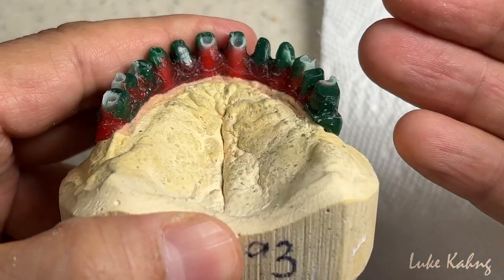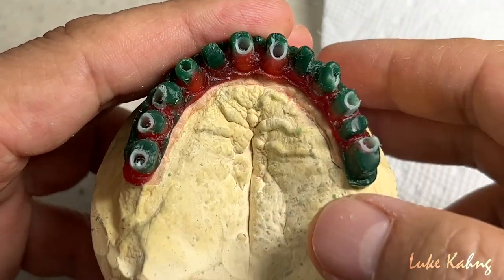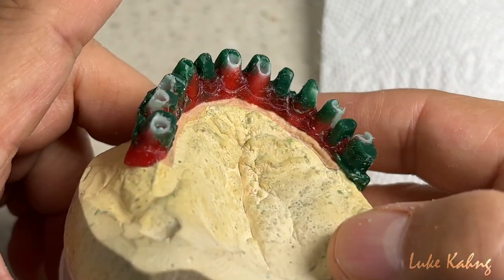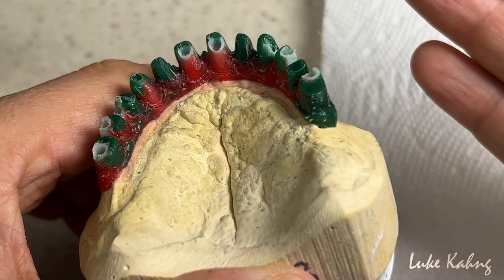So either we can cast in semi-precious metal or non-precious metal. The price will be about $1,800 for that metal, depending on the patient. For this case, we're using the non-precious metal because the patient cannot pay an additional $2,000, which I understand.